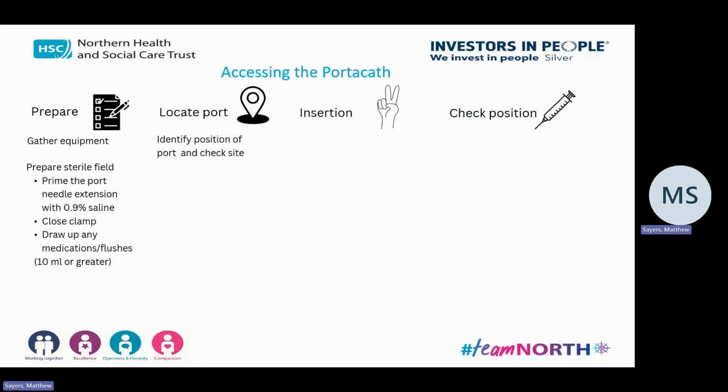And of course, the other thing that Lisa has done there as she's feeling for the site is that she's actually looking, is there any redness? Is there any swelling? Is the child, no, it's difficult with children. For those who haven't done a children's placement yet, they squeal just because you're in the room. It not necessarily shows pain, but if they were very happy with you touching everything else, and then as you press in, they show pain, you know, normal things that you'd be looking at with your line when you're identifying the position of it.